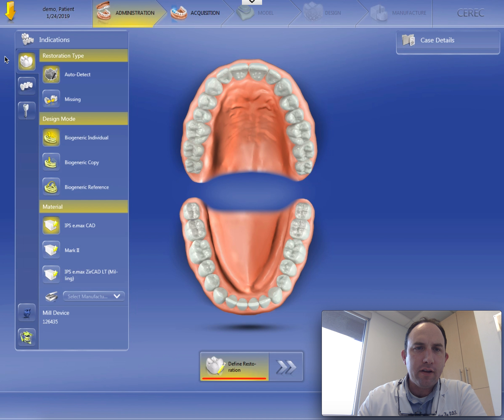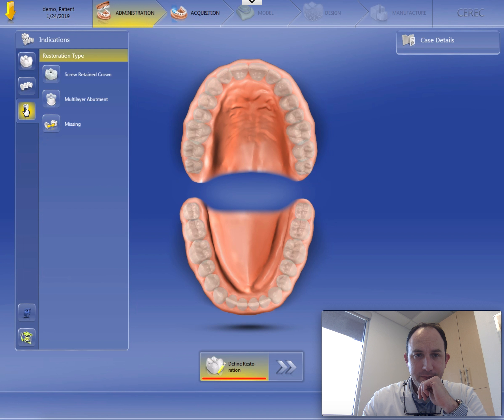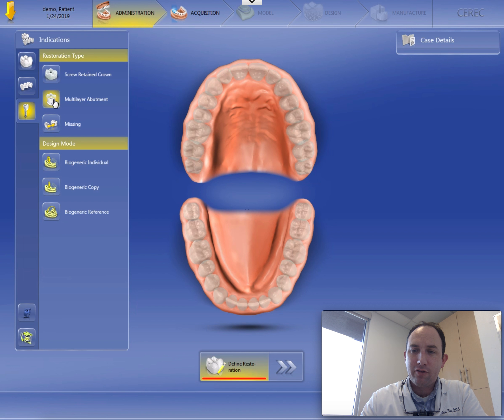You'll notice here that the computer has defaulted to what we use most commonly, which is an auto-detect, bio-generic individual, emax crown. I'm going to change that to an implant restoration. I always set them up as multi-abutment, multi-layer abutment crowns.